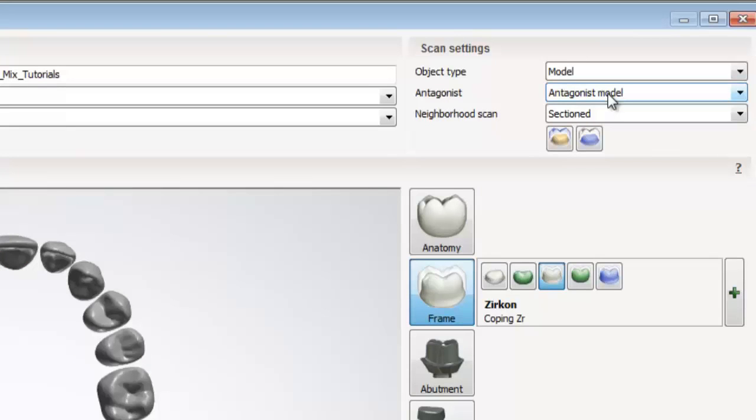Before I end this tutorial, I'd like to show you one last thing. If we look to the top right hand corner of the screen, we will see object type, antagonist, and neighborhood scan. Object type refers to what we'll be scanning.